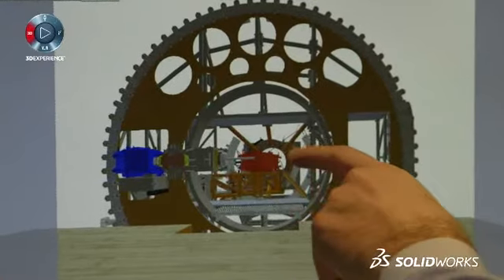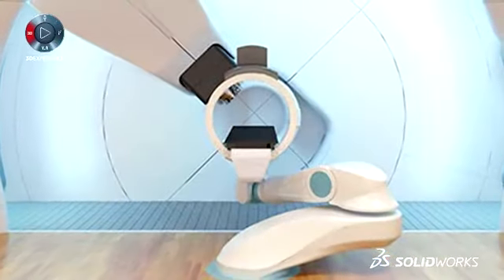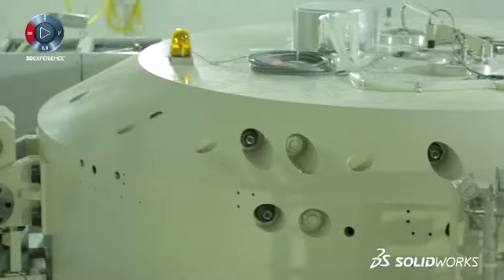It then enters a 3-story gantry, which will rotate around the patient. Basically, when the proton runs out of energy, at this final point it collapses, and that's where your treatment happens. We want a proton to stop inside the tumor and then pull an electron from that tumor cell and create water inside the tumor, so you're killing that cell. Proton therapy is different than typical radiation treatments, which just blast straight through the body. Instead, we can set how deep we're going to go and cause less collateral damage to the remaining tissue.